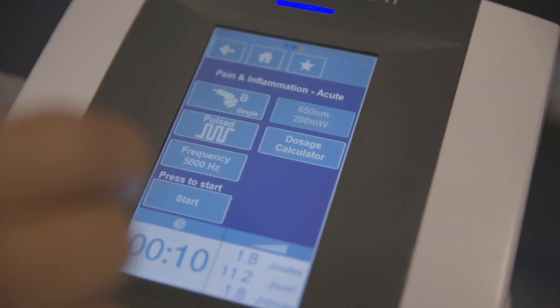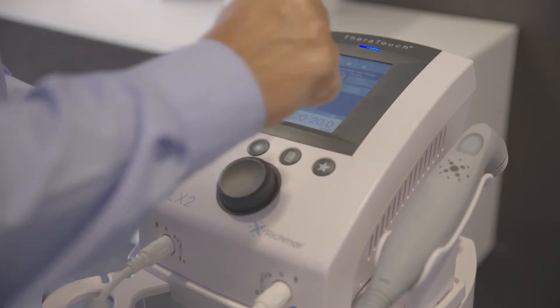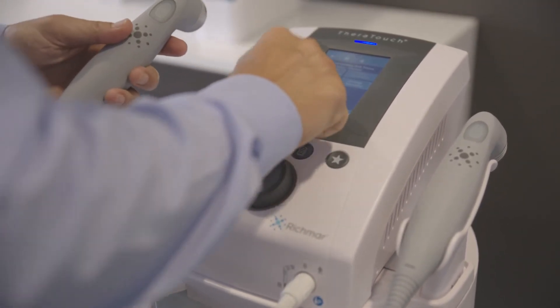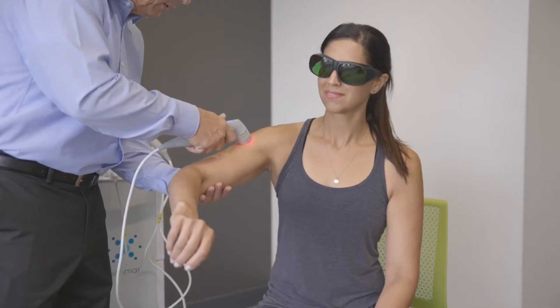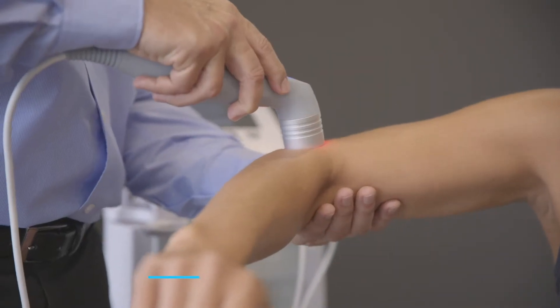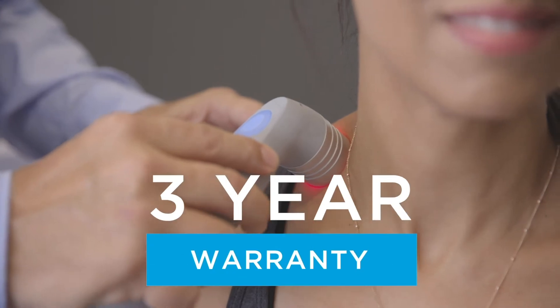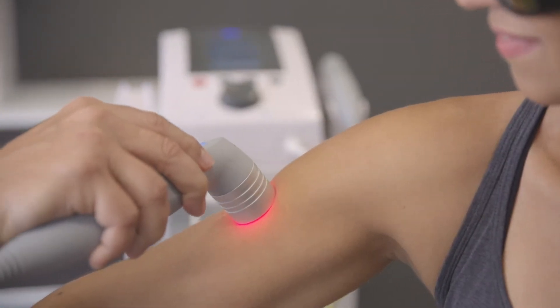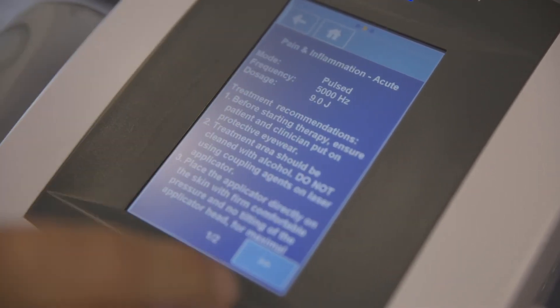The Theratouch LX2 is the only Class 3B clinical laser that comes standard with a 9-diode applicator. This means that the LX2 comes with all you need to provide low-level laser therapy, and is protected by Richmar's 3-year warranty so you can use it with the confidence of long-lasting performance.